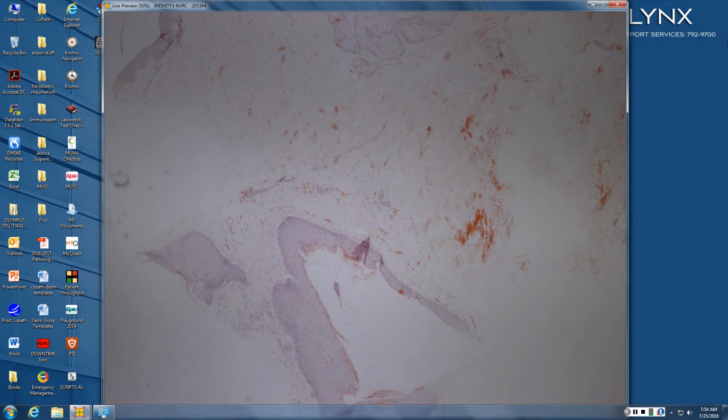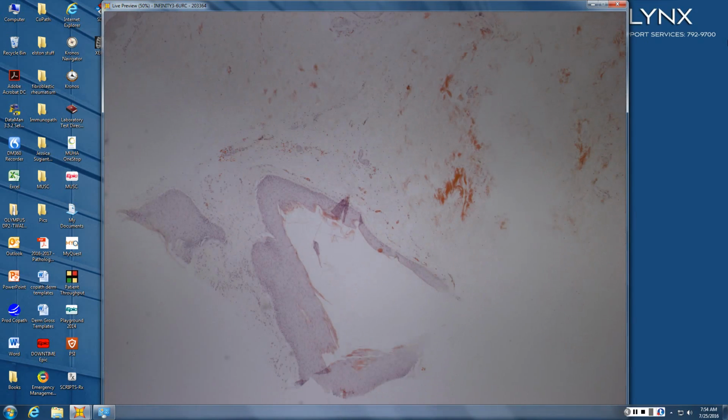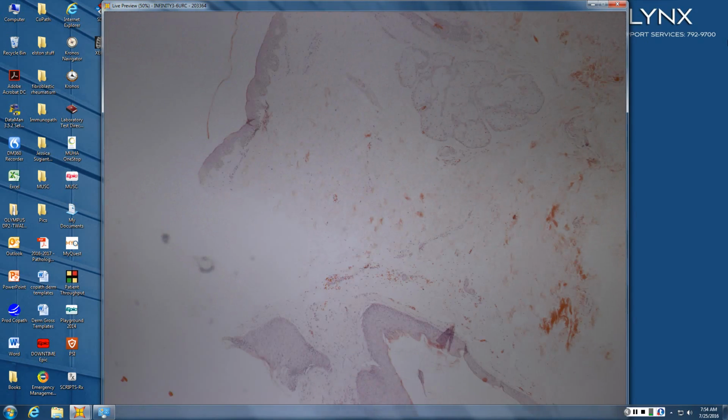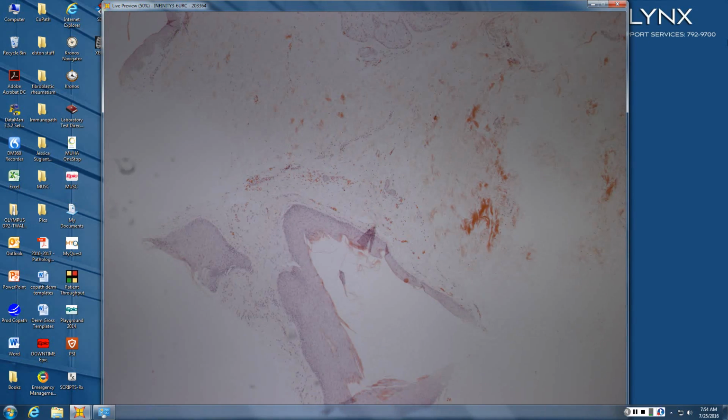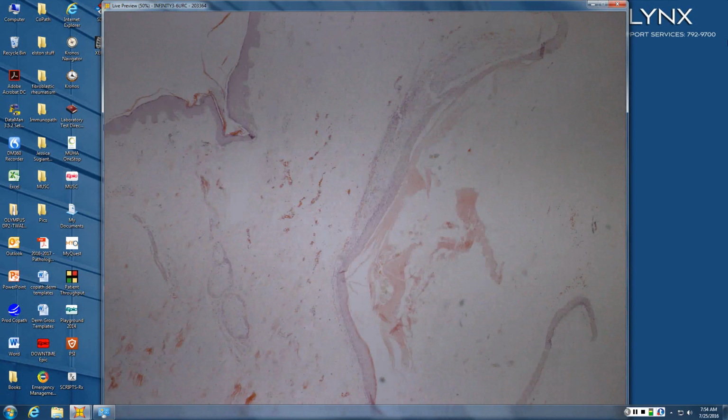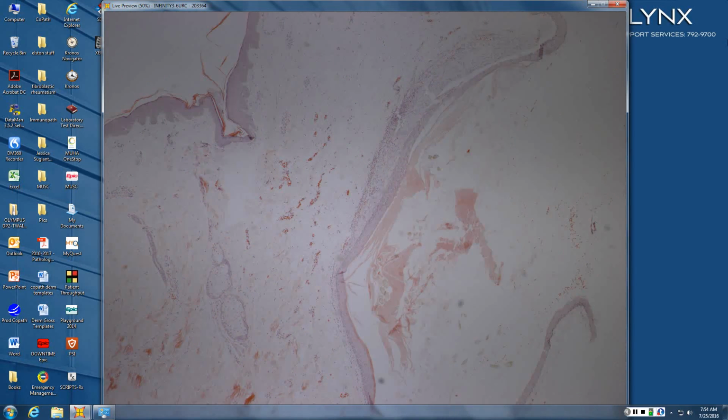Christina, what do you see here? Oh, I know it's a vellus hair cyst because you have a different shot of it where it had vellus hairs. Yeah, and this one without vellus hairs? Just very loose orthokeratin in there. And in terms of the way it's vertically oriented, you can imagine it was connected to a hair follicle. Yeah, so this is a follicular cyst, so a benign cyst of follicular origin. And then in the other cut, it's filled with vellus hairs.